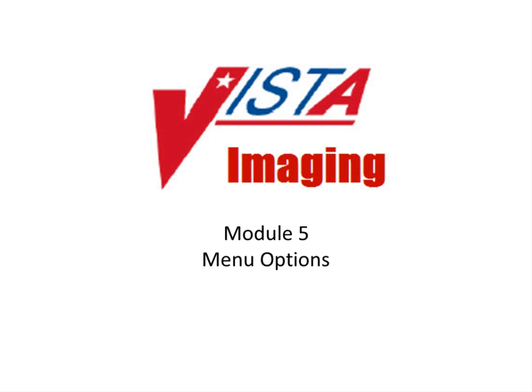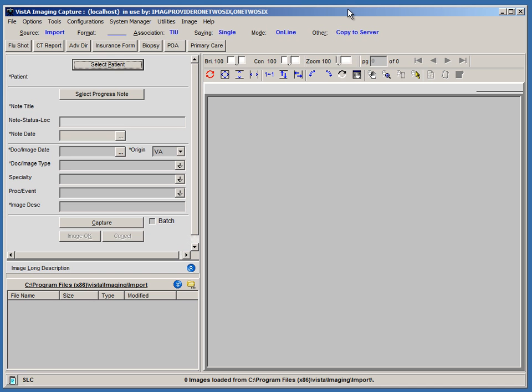This is Module 5 in the series of Vista Imaging Clinical Capture training modules, and it will cover the menu options in the Clinical Capture application. It is suggested that the modules initially be viewed in sequential order to become familiar with the options necessary to perform document scanning and image captures. Additional information about the menu options can be found in the current Clinical Capture user manual.